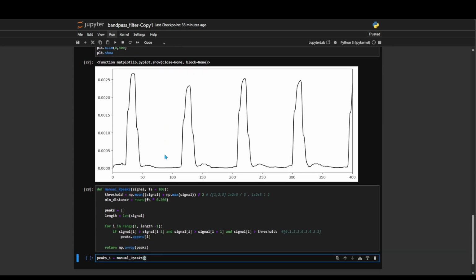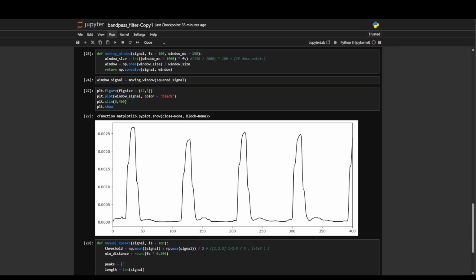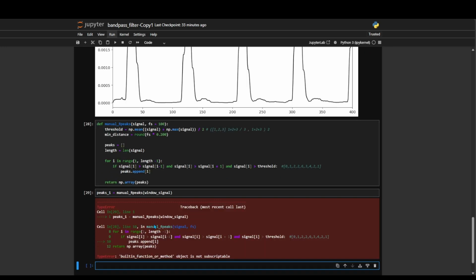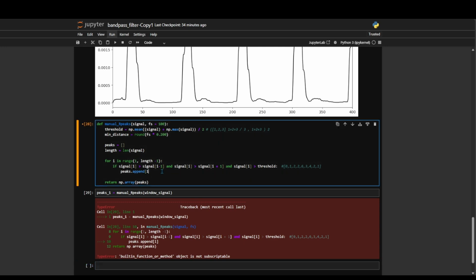What was our last window signal? Oh yeah.